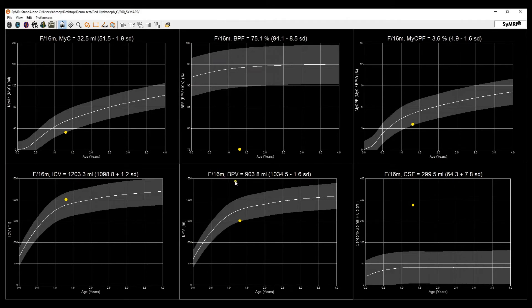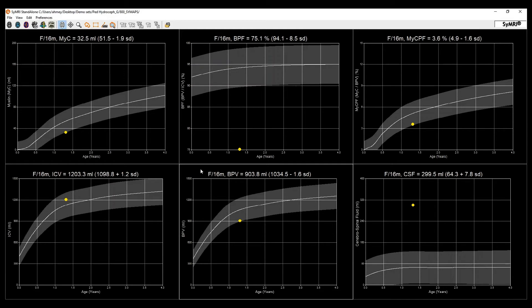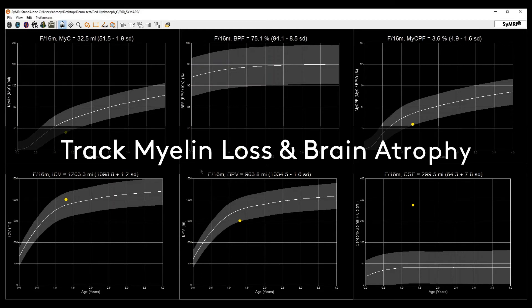These curves can also be used in milder and earlier stages of disease, helping provide the physician with earlier signs and indications of myelin loss or brain atrophy, with the ability to track these losses over time.